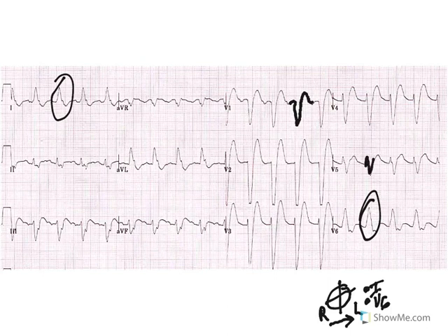That doesn't tell me much. But boy, look at AVL. AVL is almost all upward, big R waves, right? Big R waves in lead 1, lead V6, big R waves in lead AVL. That means everything is going towards those lateral leads because it went down the right side and had to come backwards using all of the back roads to depolarize the left.